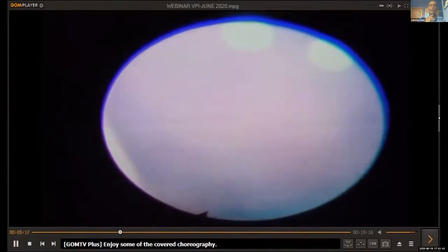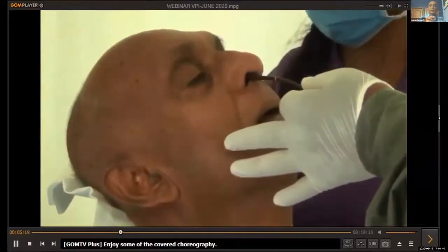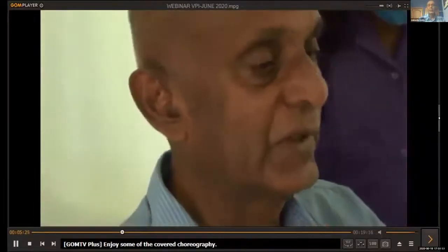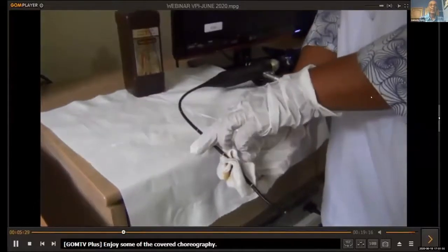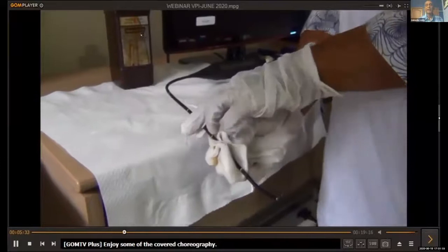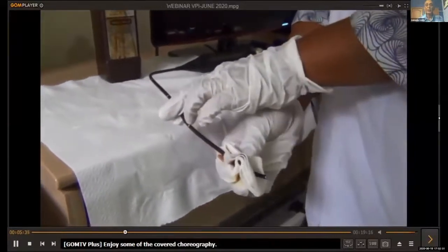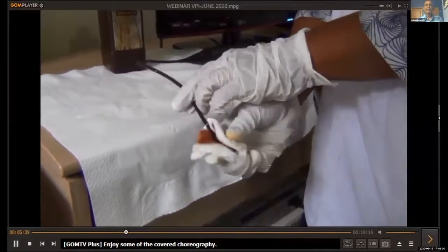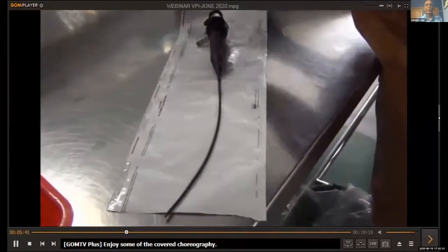Once you finish with the endoscopy, after it is removed, the next thing is how to sterilize this. Immediately it is kept on a sterile paper, then it's cleaned with betadine solution or povidone iodine. It's available everywhere. So the sister cleans it gently this way, but that's not sufficient in the COVID scenario. So it is sent for sterilization again.